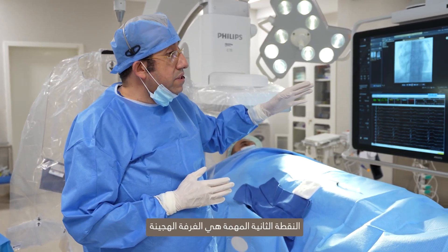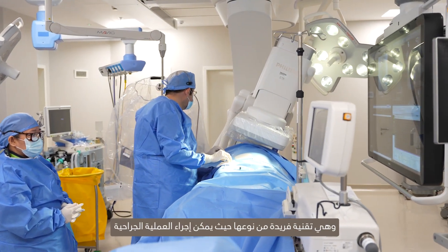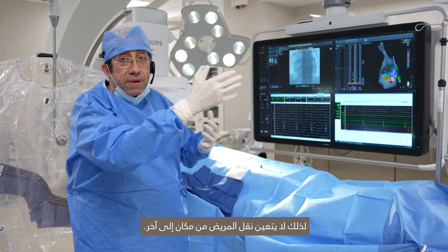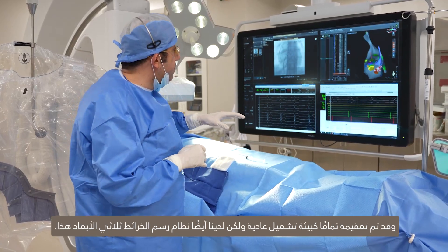The patient has no pain and they're not really aware of what's happening inside. The second important point is this is a hybrid room — a unique technology where you can do operative procedures as well as catheter procedures, both at the same time in the same room. So you don't have to move the patient around, and it's completely sterile, as you see, like a normal operating room environment.